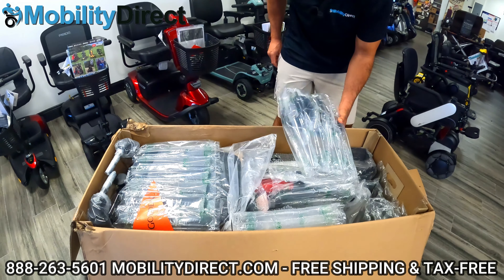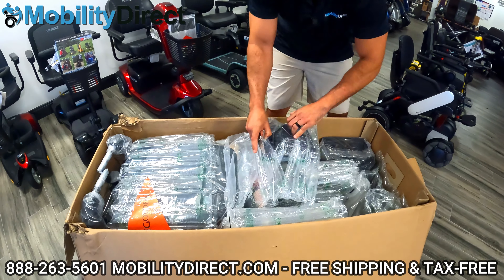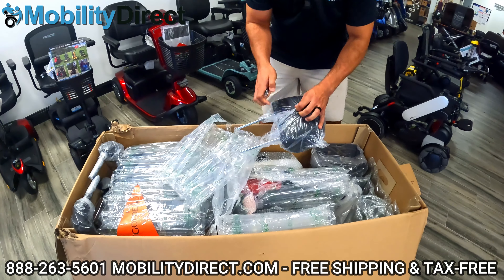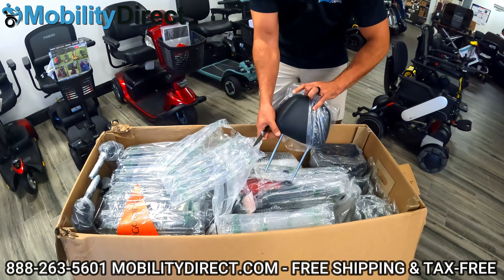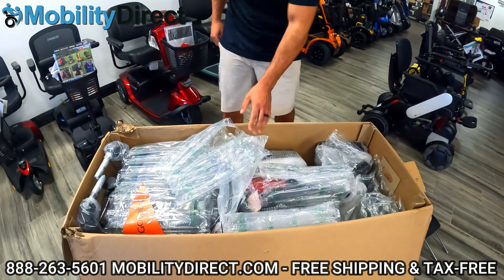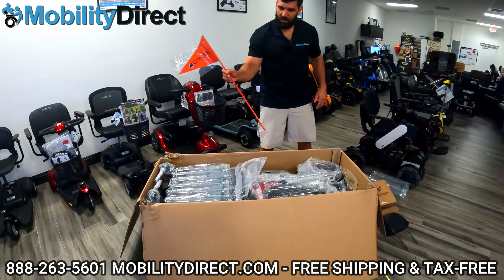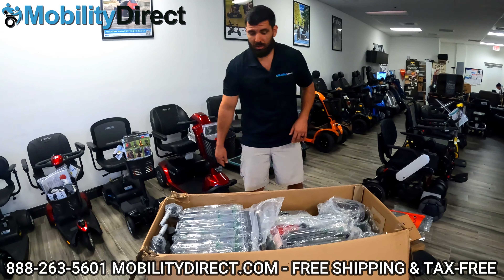I'm going to start taking things apart one at a time carefully. You want to be real careful when you're cutting the tape on the packaging for the headrest — that's what this is. You definitely want to be careful cutting the tape that's keeping the plastic on it. Don't cut into the headrest or the seating. So that's the headrest — I'm going to put that to the side. Every Golden scooter comes with a safety flag, which you can use to let people know you're coming from behind them and keep track of your loved ones.